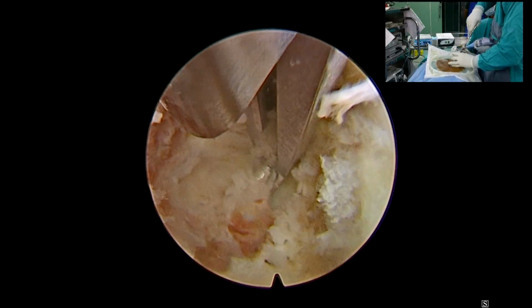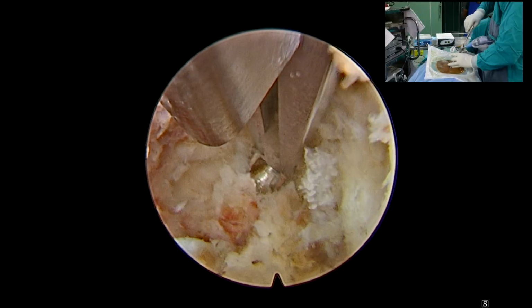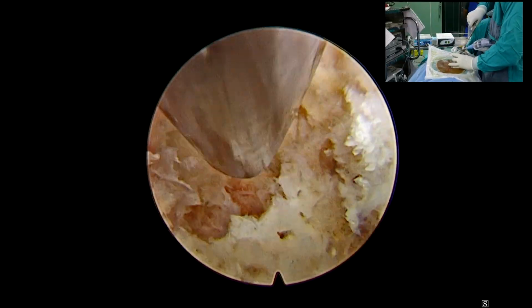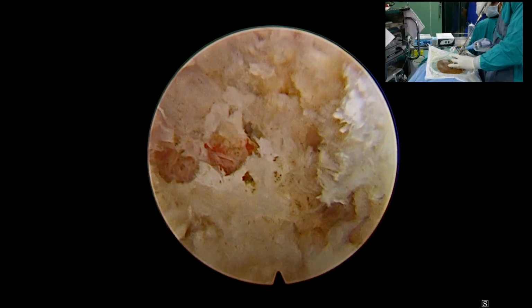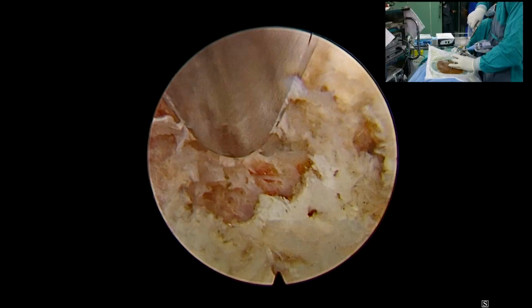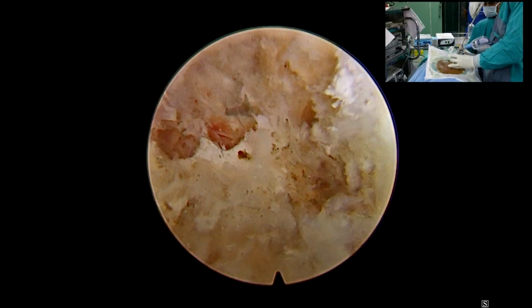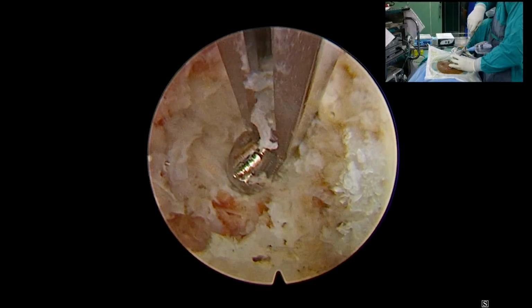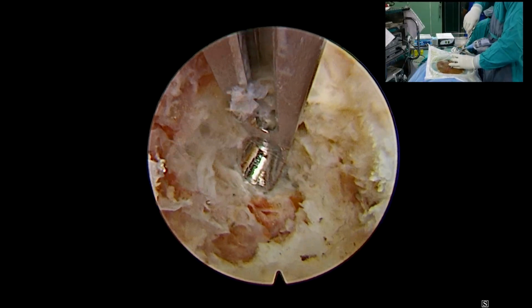If you pull the Kerrison up, the structures below might also get pulled up. In most of these pathologies, the dura is attached to the flavum, so there might be a tear of the dura if we pull it up. That is why we always use the Kerrison under the surface of the bone and chip the bone from the sides.